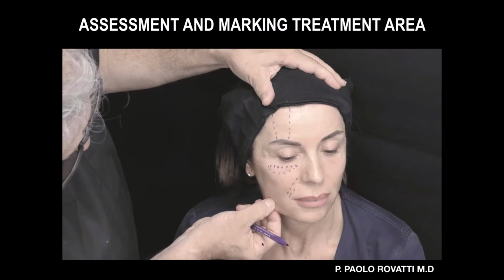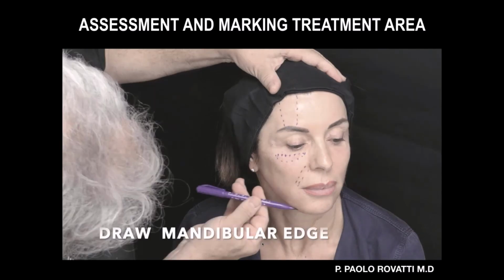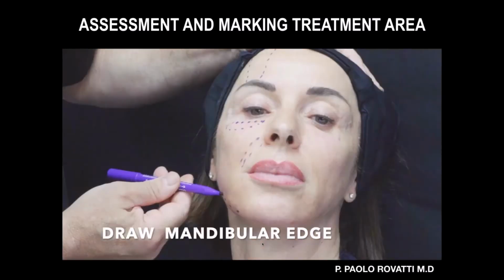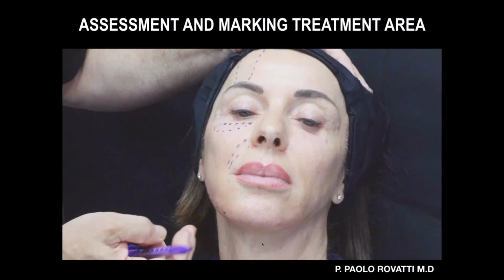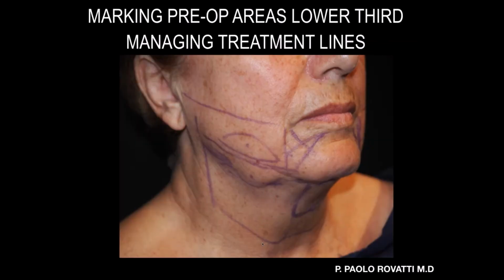And so this is for the jawline. We draw the mandibular edge. So we don't treat on this line, but we will treat below and above this jawline. The nasolabial fold, we see that I'm treating the fat just above the ligament. So this is my marking. This is the line where I don't want to treat. This is in green what I'm doing. So I'm treating above and below the jawline where the fat is drooping down.